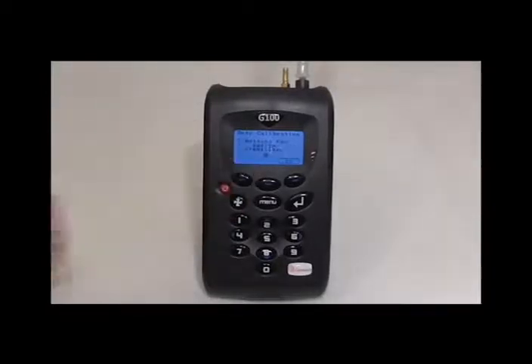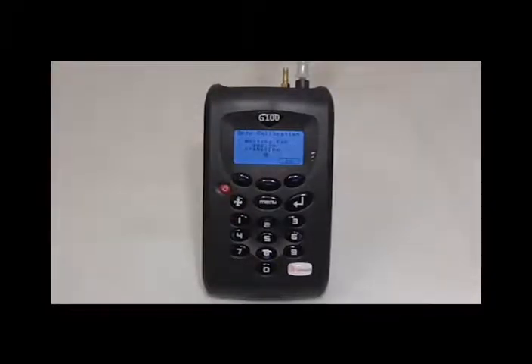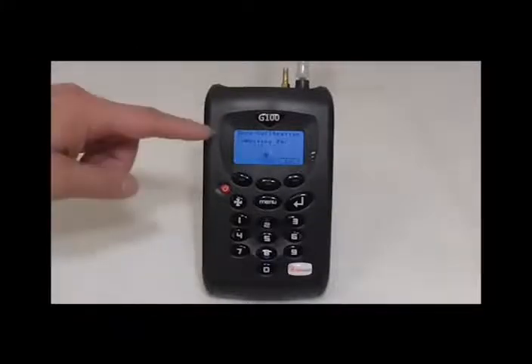Once the 5 minutes is over, press start and the calibration will commence. The instrument should complete successfully and then you can press accept.